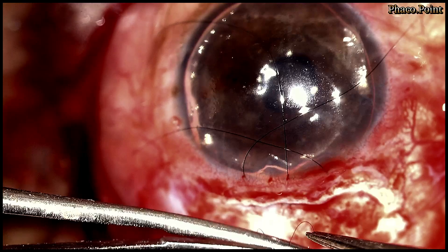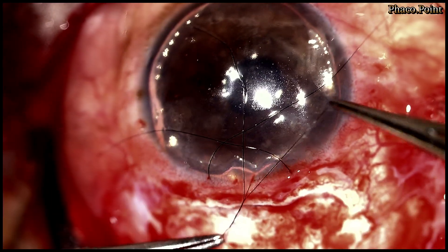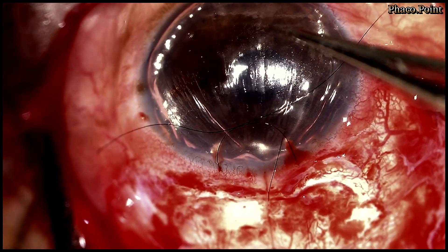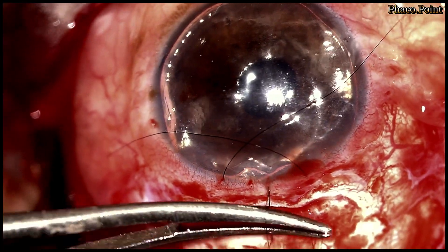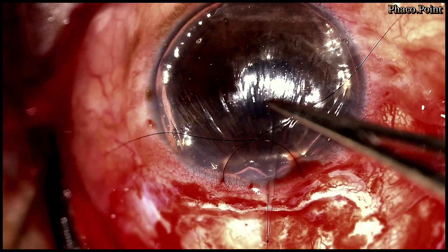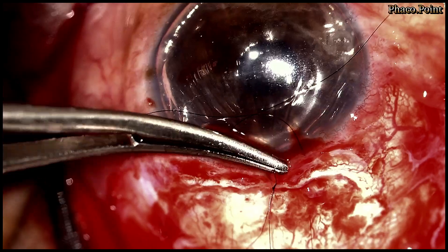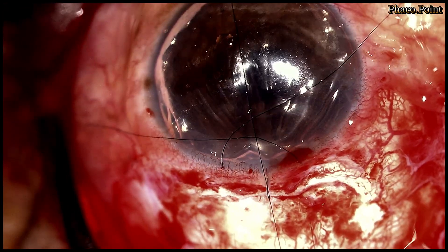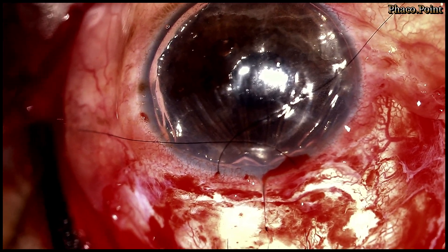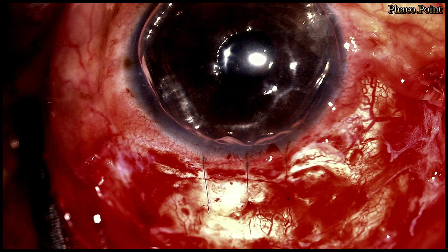Each of these sutures is tied with a 3-1-1 buried knot. Tying of the suture should always happen with a well-formed anterior chamber to be able to properly gauge the extent of tightness required for each suture. Having completed one suture, the other two are taken in exactly the same manner. This, as you can see, is at the end of suturing a well-opposed main SICS tunnel.